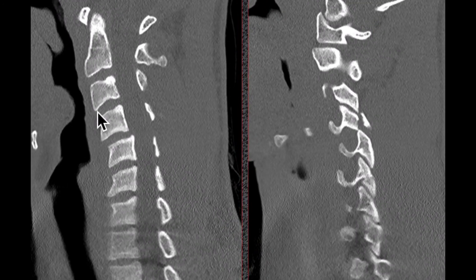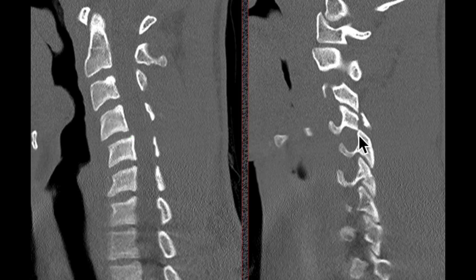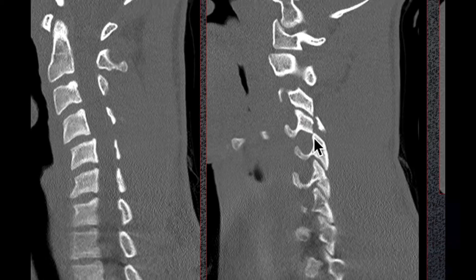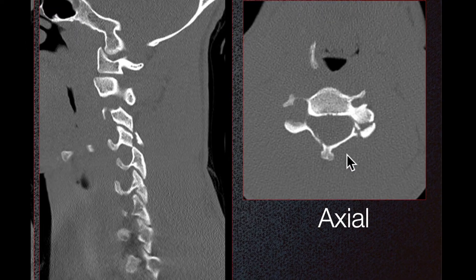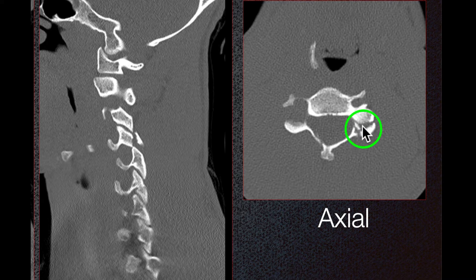Here we can see mild anterior listhesis of C4 over C5. On the lateral side on the left, we can see a perched and fractured C4 facet, which is perched on the superior facet of C5. On axial imaging, we can see the left perched facet with fracture, and a fracture of the right lamina, also demonstrated here.